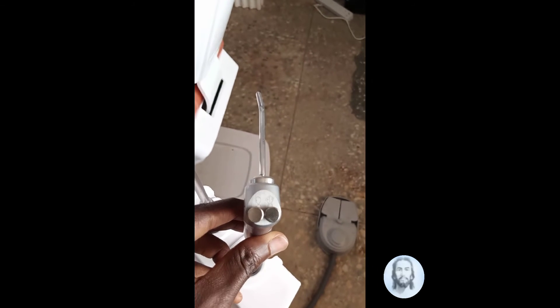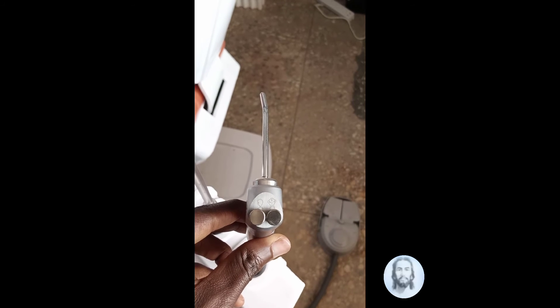Here is the water and air injector. Here is the smaller sputum suction, and this is the larger sputum suction.